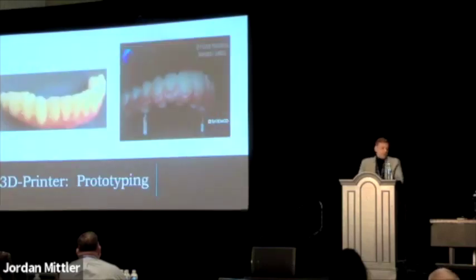So this is just some pictures of some of the prototypes, right? When I tell you the same day provisional, that's going to be the day of surgery, and I call them prototypes more when I'm going for my final option. And so it's really, really an amazing situation.